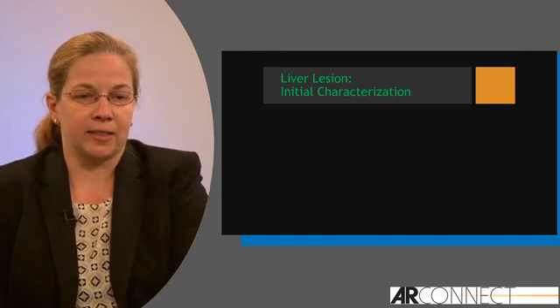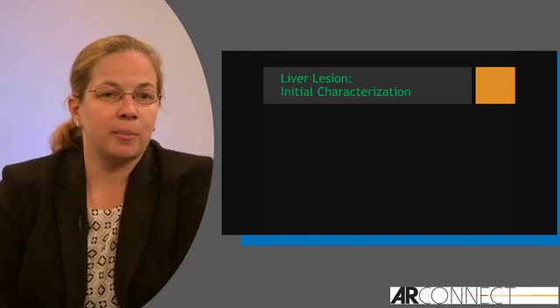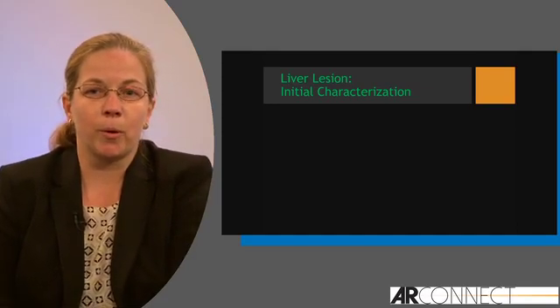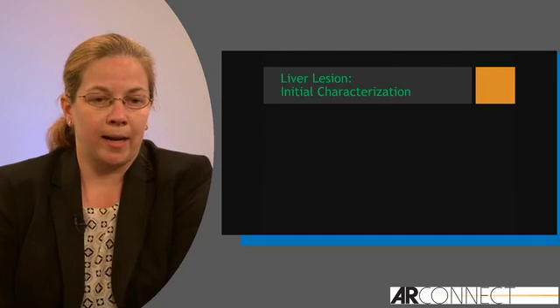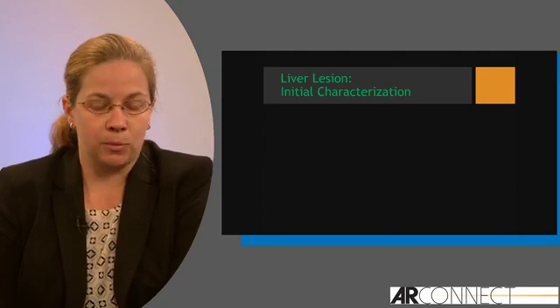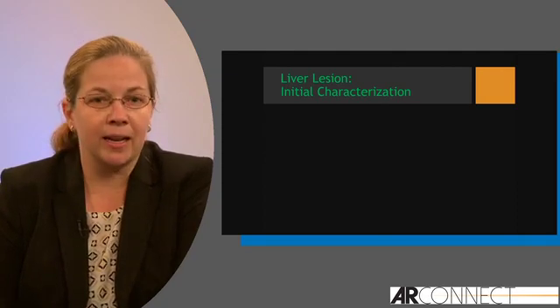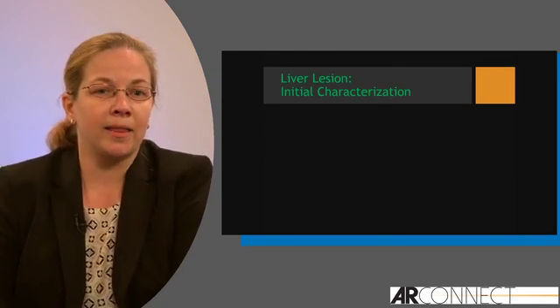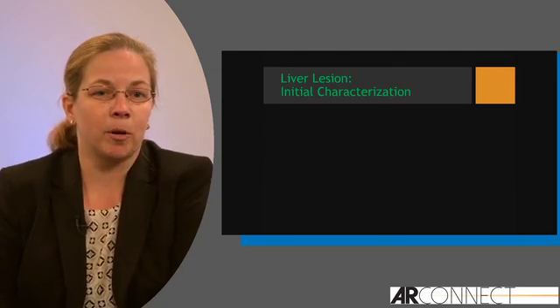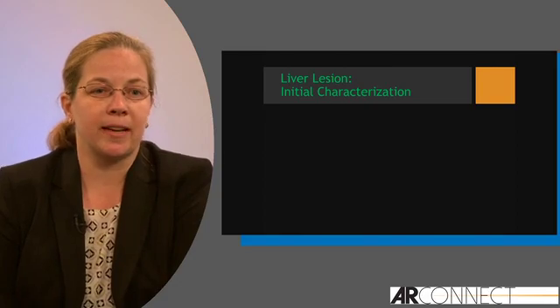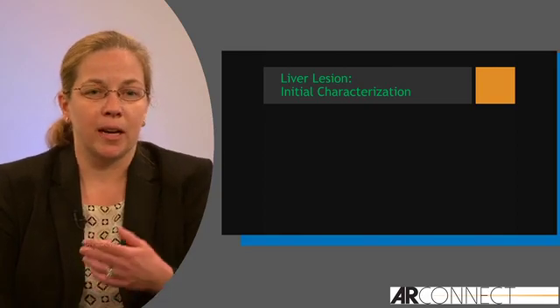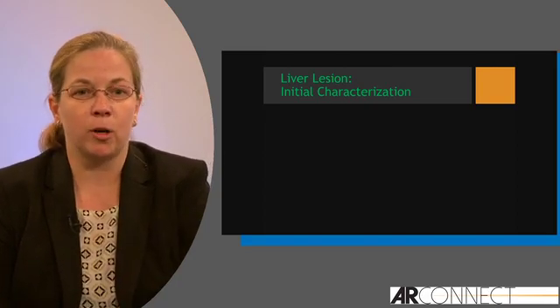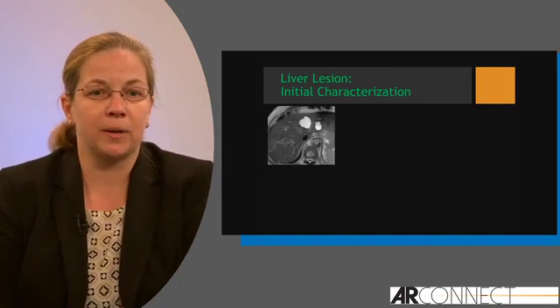Liver lesion characterization. As a body imager, this is probably one of the more important instances where I feel that I need contrast enhancement, and why the ACR appropriateness criteria has deemed contrast-enhanced MR usually appropriate in this situation.